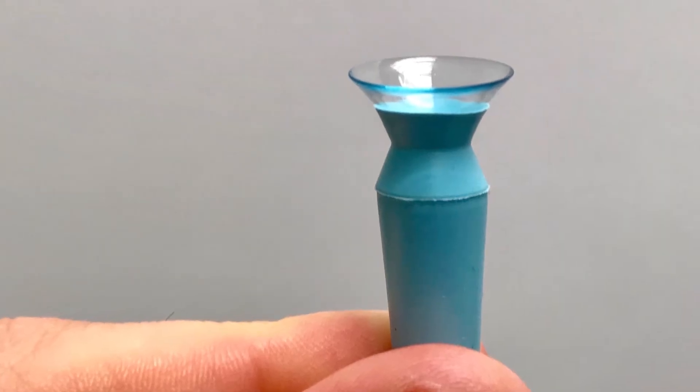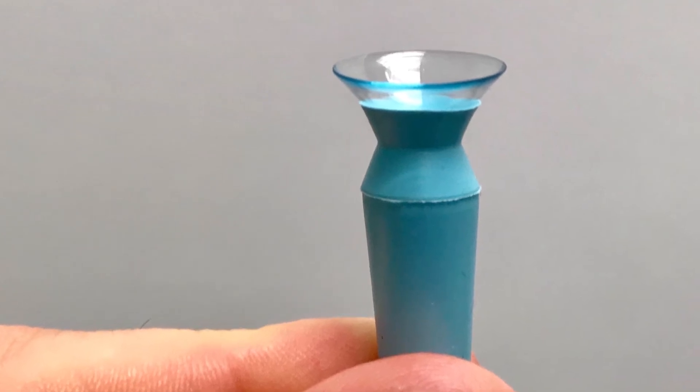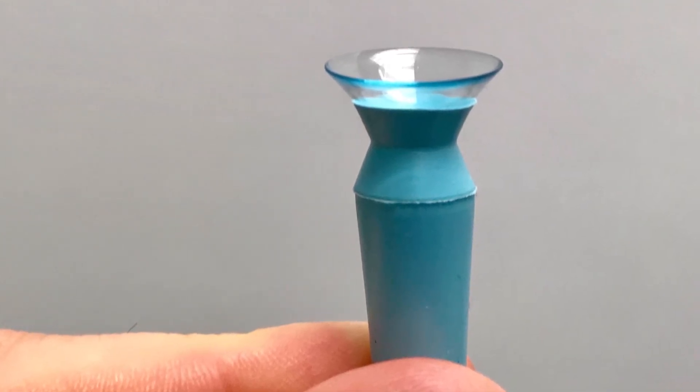Taking out scleral contacts is different than taking out regular lenses. Most patients prefer to use a scleral plunger to remove these lenses. Like standard hard contact lenses, scleral lenses can last for up to two years. This all depends on how you take care of them, how you're seeing, and how they fit your eye.